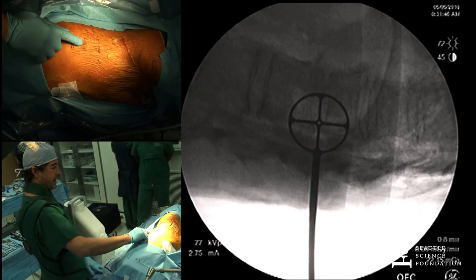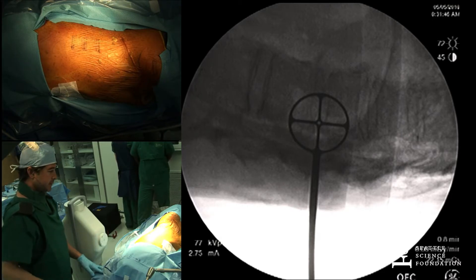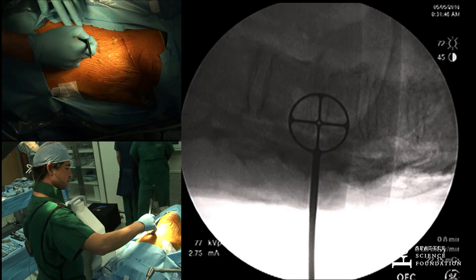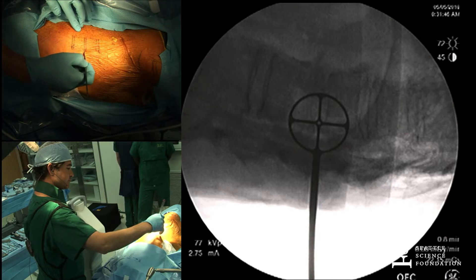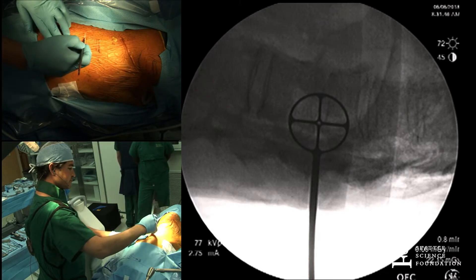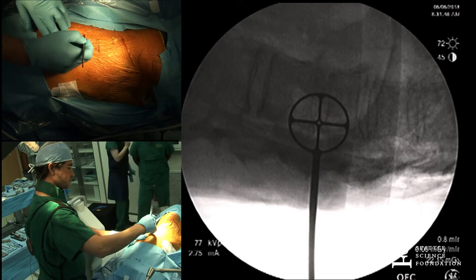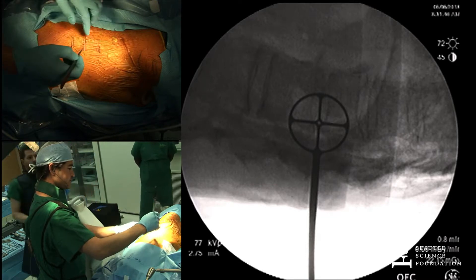We're going to go ahead and try to access — I think this is T8, T9 right here. In the clinical world, this is the perfect approach for thoracic herniated discs — this is like the best highlight — or metastatic lesions, for example. You can leave the pleura intact, and you won't risk dropping cells into the chest; you keep that barrier that is the pleura intact. It's a really good setup.